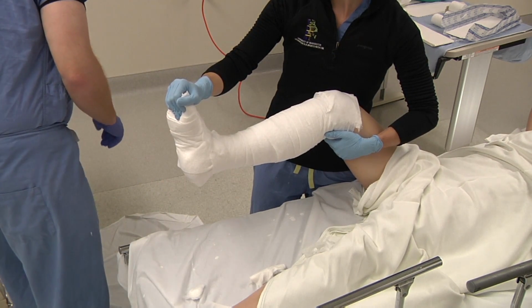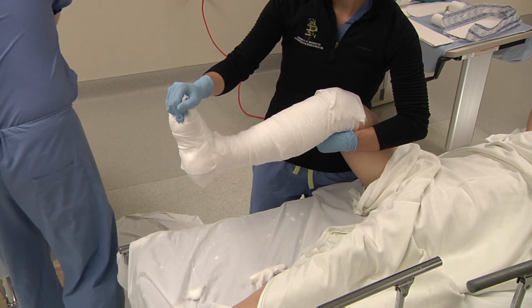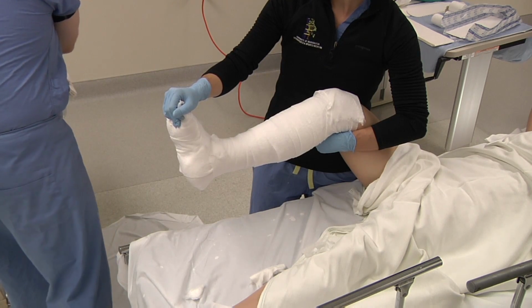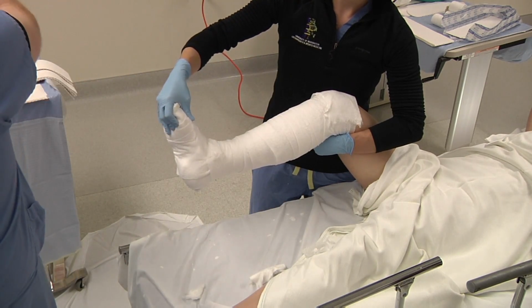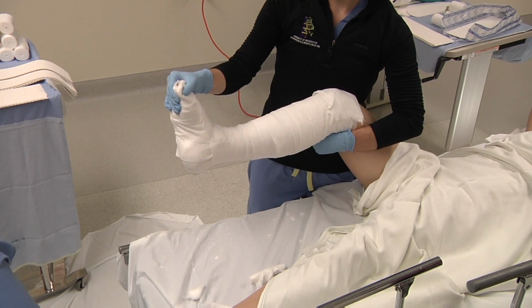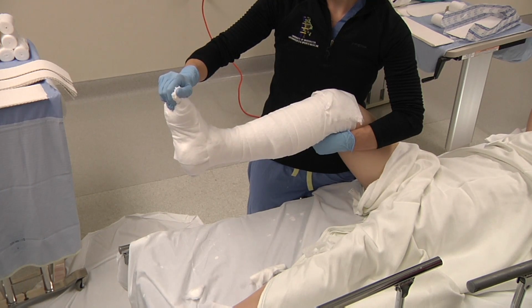We do this typically in 2 different segments, the short leg and then the extension of the long leg. So now we will apply our short leg. Make sure we've got adequate padding. We dip our plaster. Laminate, laminate.